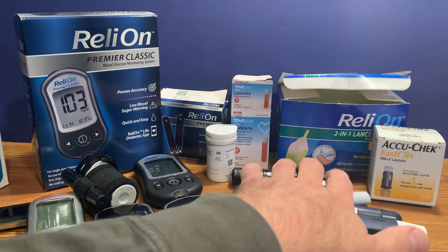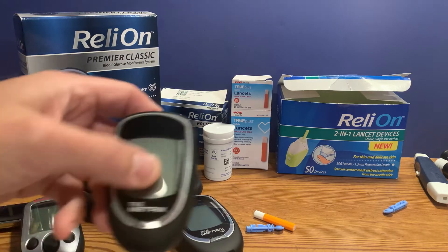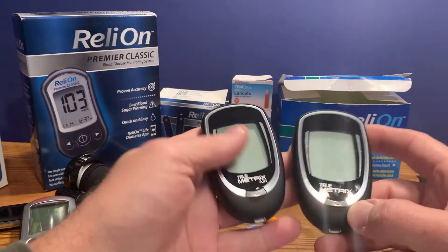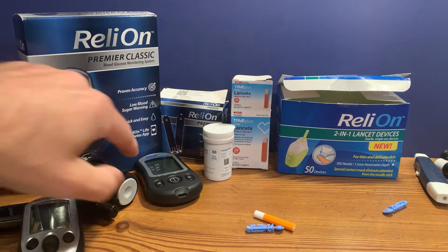Then you need the meter. There are many meters available. True Metrix is available as a store brand in many stores. They have the Air and regular True Metrix, as well as the True Metrix Go as a portable version.